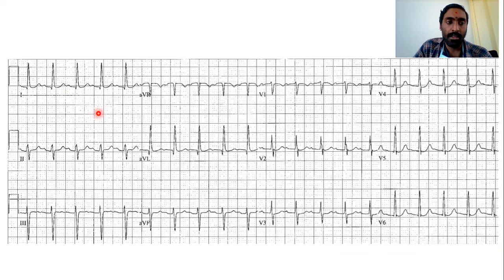So coming to this ECG. This is the ECG of a person who has a normal standardization with normal sinus rhythm, with AVR negative and lead 2 positive. Then we look at the heart rate, it is about 300, 150, 100. So it's more than 100. So this is a sinus tachycardia. Once we have sinus tachycardia, let's look at the intervals. The PR interval appears normal. For the QT interval, we have to calculate the corrected QT. Here it appears normal.